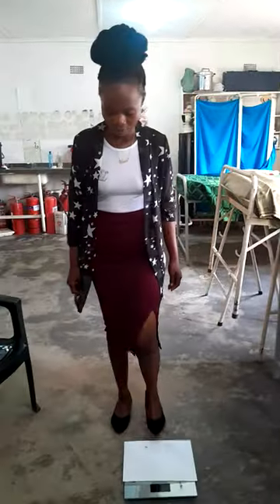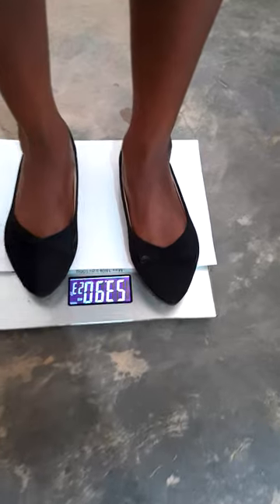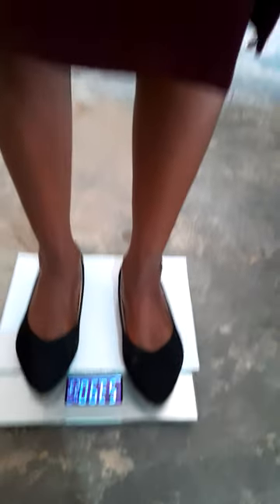If the patient is wearing any heavy clothing — for example, a heavy jacket — the patient can remove that jacket. If they're carrying a bag, they should remove the bag. Any heavy items the patient has, they can remove. So at this moment, you can step off the scale and then get back on. As you can see, she is weighing 53.9 kilograms. That's the weight, and you can document 53.9 kg.